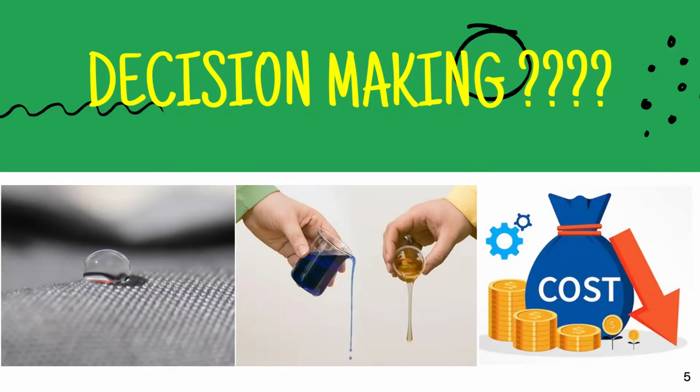The first deciding factor would be the wettability of the material. What is wettability? Wettability refers to the material's ability to flow easily and evenly and capture the fine details. The next factor which can help you decide would be the consistency of the material.